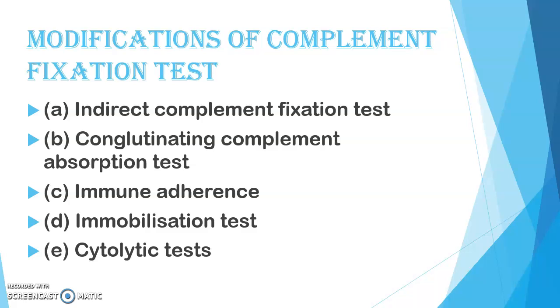Now fourth is the immobilization test. In this test, antigen is incubated with the patient's serum in the presence of complement. If specific antibody is present, it would immobilize the antigen. An example is the Treponema pallidum immobilization test, considered the gold standard for the serodiagnosis of syphilis.